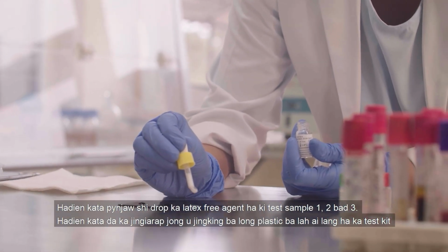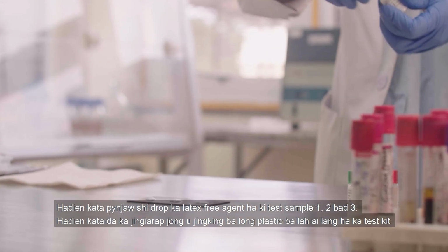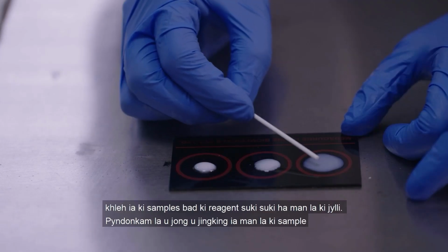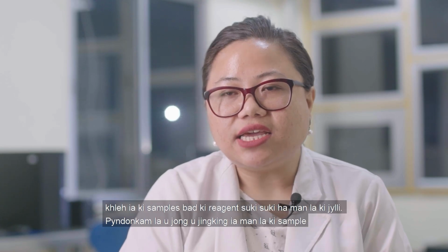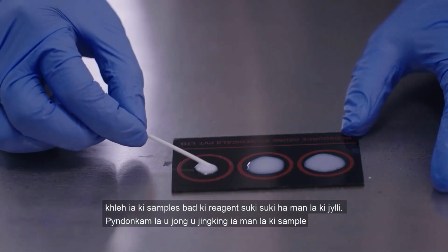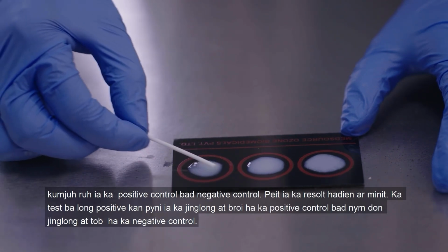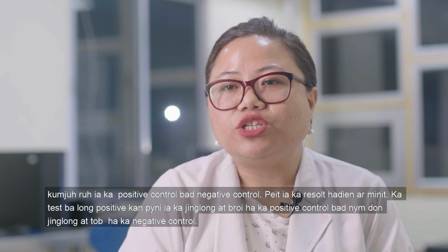Next, add 1 drop of latex reagent to your test samples 1, 2 and 3. Next, with the help of a plastic stirrer that has been provided with the test kit box, mix the samples and the reagent gently and within the enclosure of the circle. Use a separate plastic stirrer for each sample, including the positive control and the negative control. Read the test results within 2 minutes.